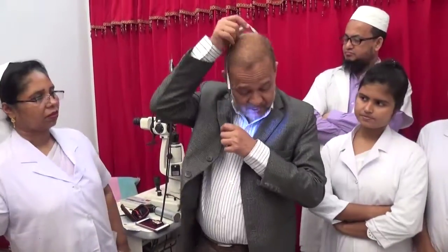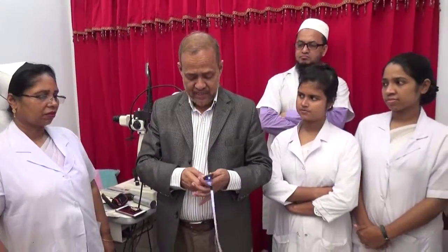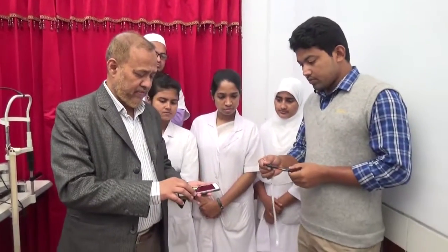I now request Mr. Basharuddin to show us how to align a smartphone with this ArcLight, how to take a photograph, and how to document the findings.